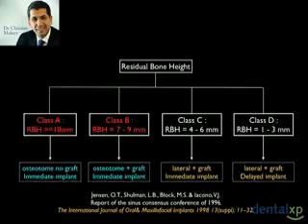In cases where we had 10 millimeters or more, we had to use, if we follow this consensus conference, the osteotomes with no grafts. And for cases where we had residual bone height of 7 to 9 millimeters, it was stated at that time that we should use the osteotomes with some bone graft and immediate implant placement. We will see throughout this presentation if this classification is still current.